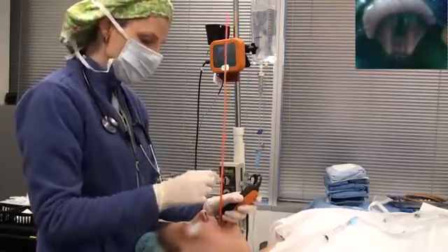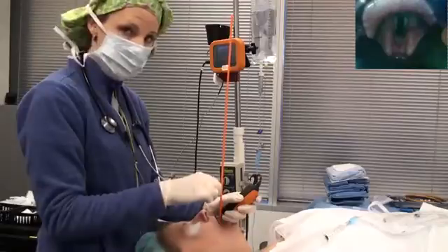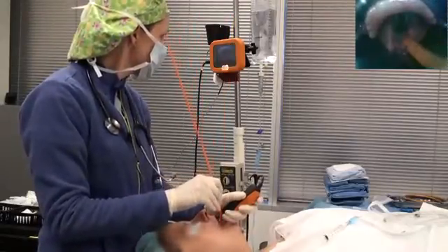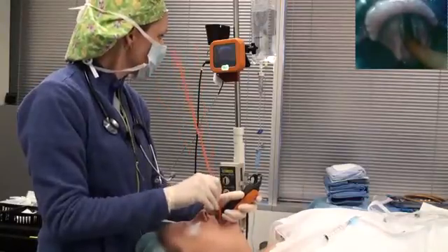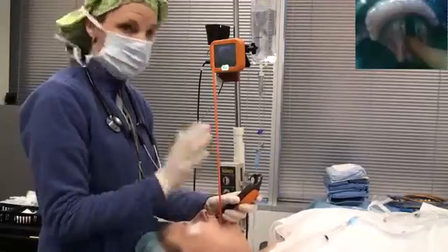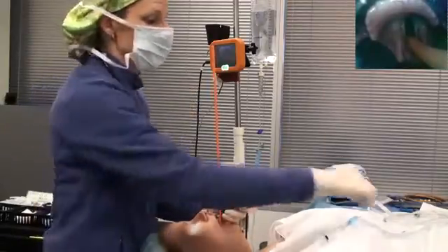Then take your bougie. It's easier if you hold it a little bit closer to where the sheath starts, and then you want to just slowly advance forward. It just has to disappear between the vocal cords. You don't have to ram it down into the corina because you can already see where the bougie is.